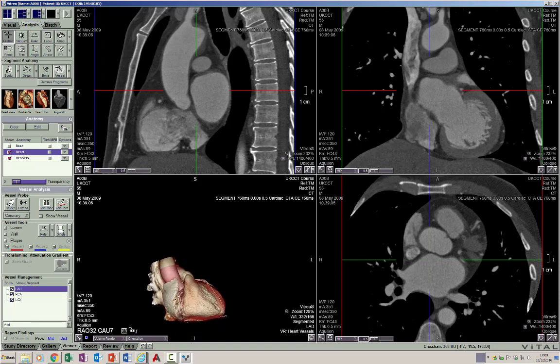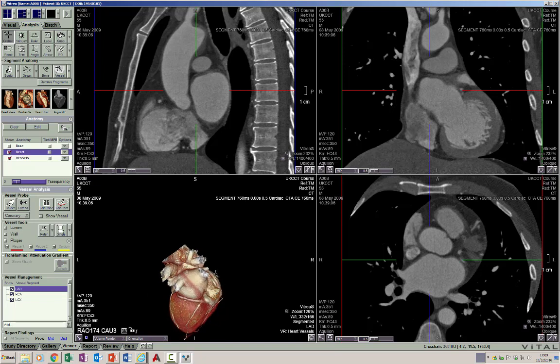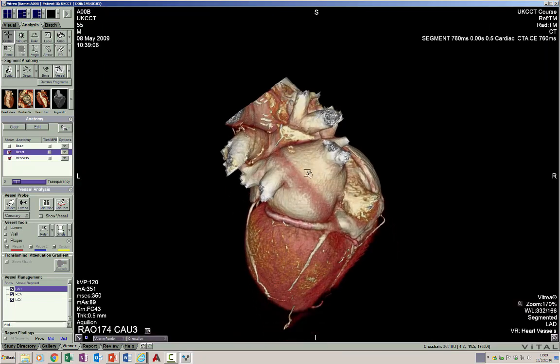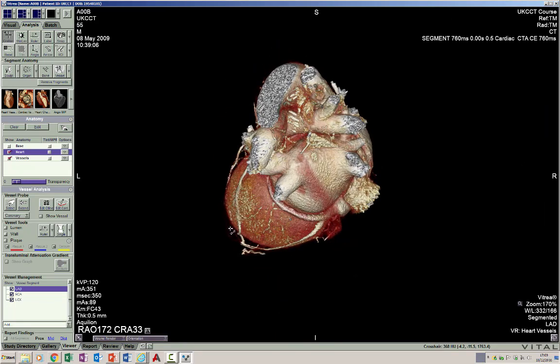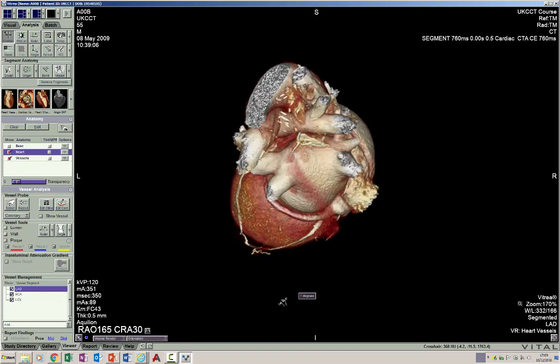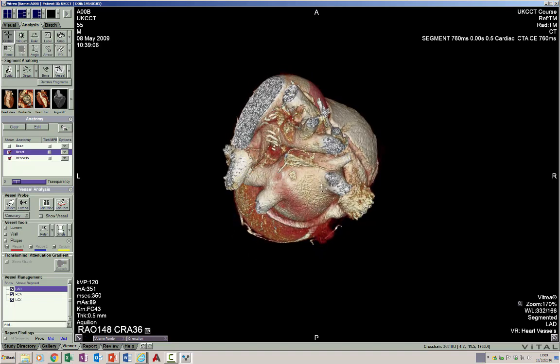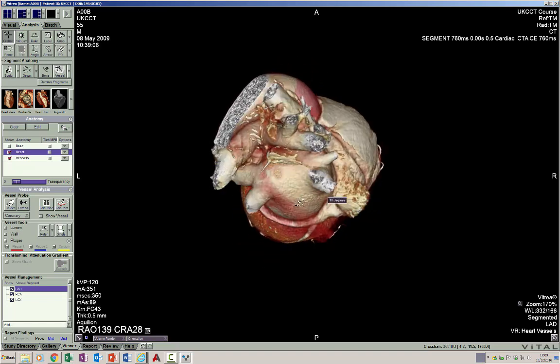We can see these pulmonary veins nicely on 3D images. On the left side we have the left superior and left inferior pulmonary veins, and on the right we have the right superior and the right inferior pulmonary vein.